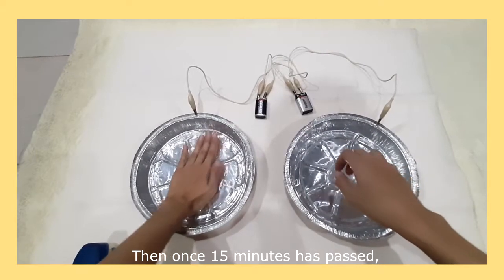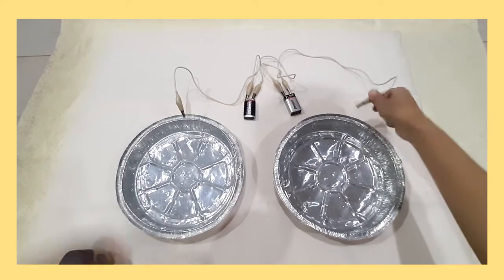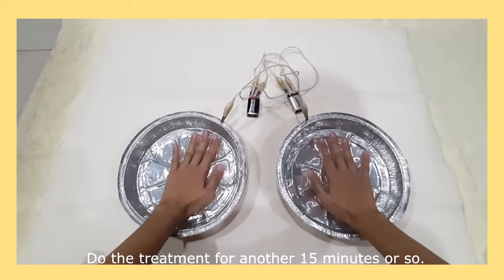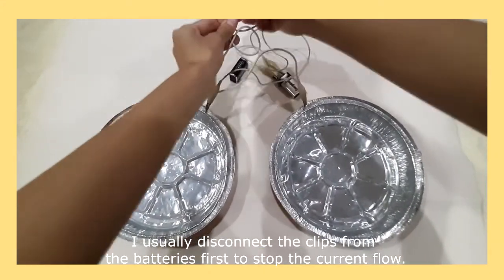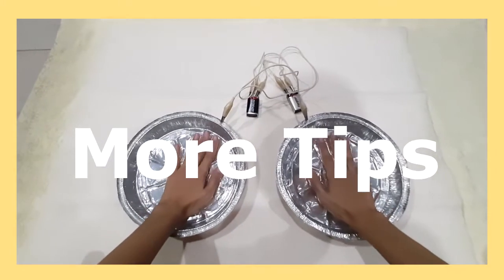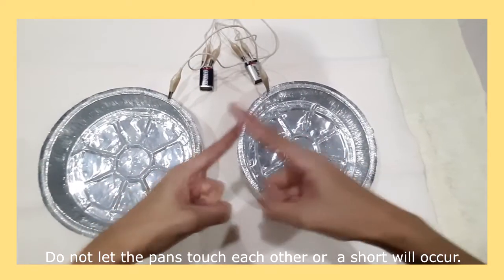Once 15 minutes has passed, lift your hands from the pan one by one and slowly. Pat your hands dry with a towel, then reverse the alligator clip connections. Disconnect the clips after the treatment. Really important: the stainless steel trays or aluminum pans should be placed on a non-conducting surface like wood, or you can also place them on a cloth. Do not let the pans touch each other or a short circuit will occur.